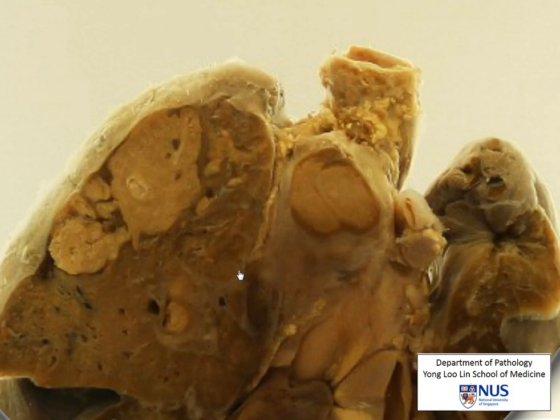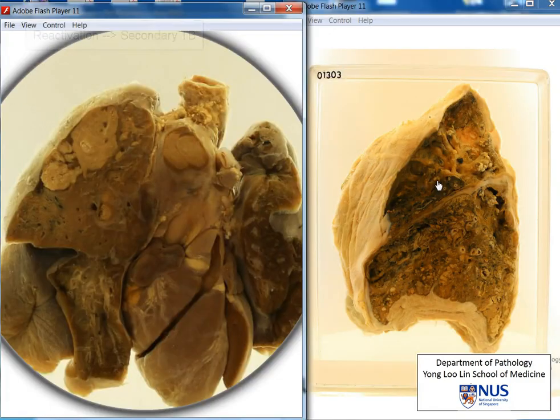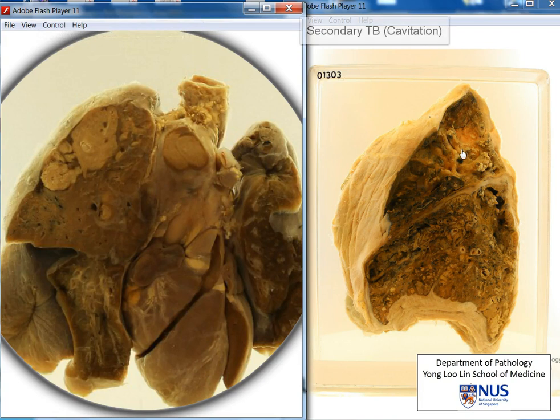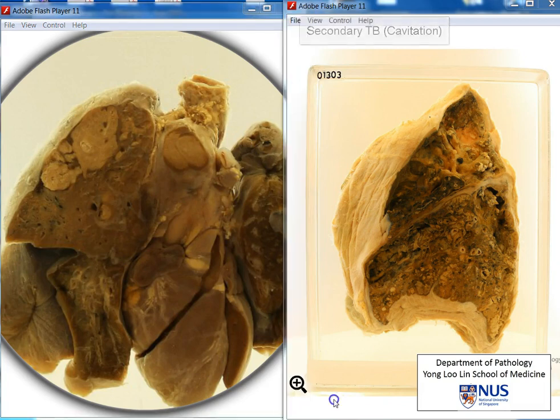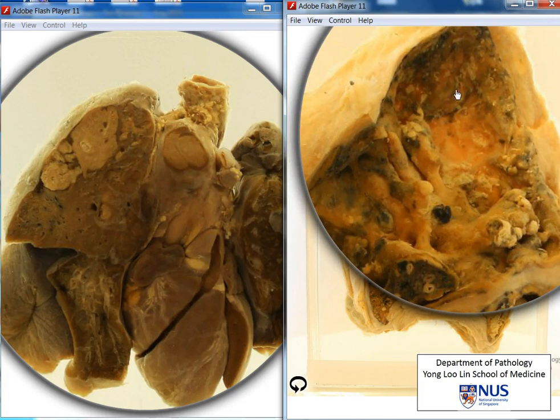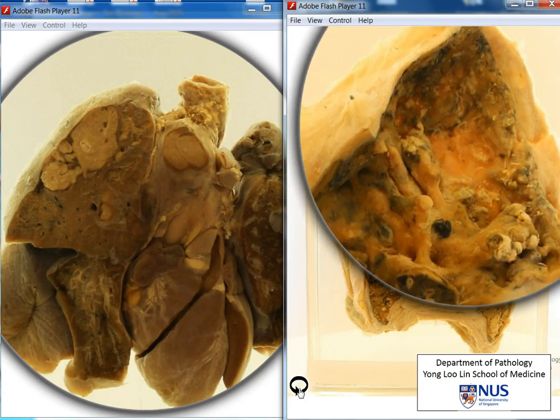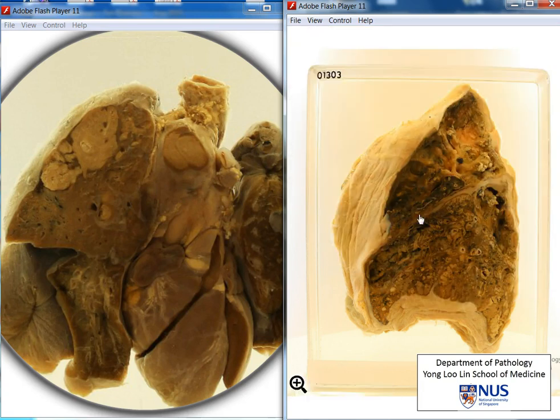This reactivation is known as secondary TB. It is not seen here, but usually in secondary TB, this is a cavitating process. Here is an example of secondary TB, where you can see that there is obviously an area of cavitation. This is often a very necrotizing process in secondary TB, because the body has already got a previous immune response and recognition of the antigens in TB, so there's a very strong immune response mounted when there is a reactivation.